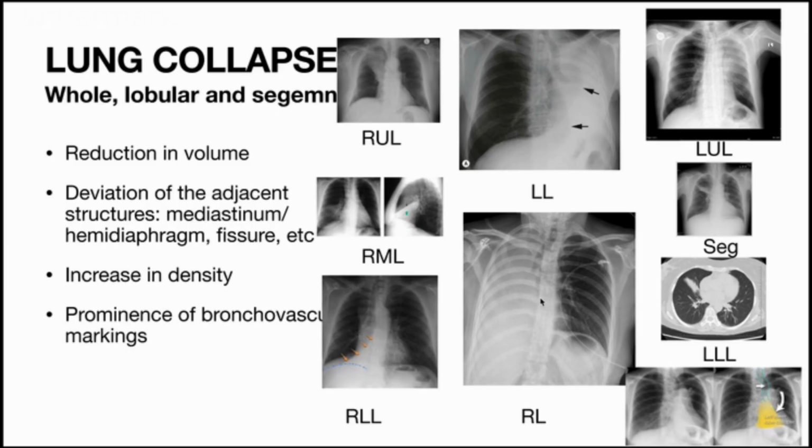Otherwise, the chest wall, the hemidiaphragm, and then you conclude. Maybe that is a better way of presenting your report. So then you are able to say, yes, this is this condition, then you can usually do a CT scan. Okay, so in a nutshell, this is what we are talking about.